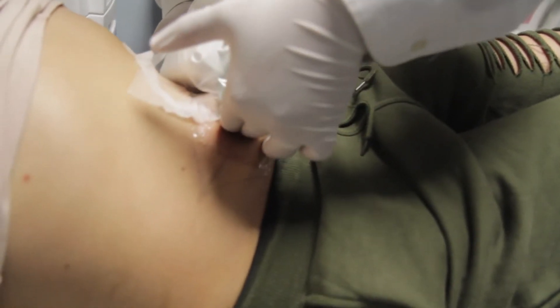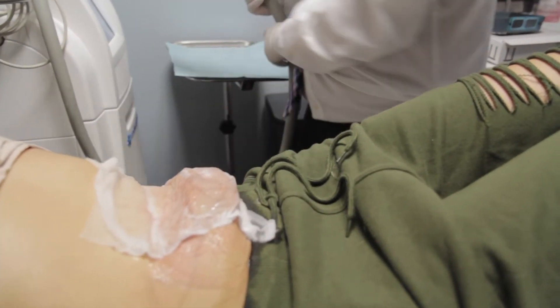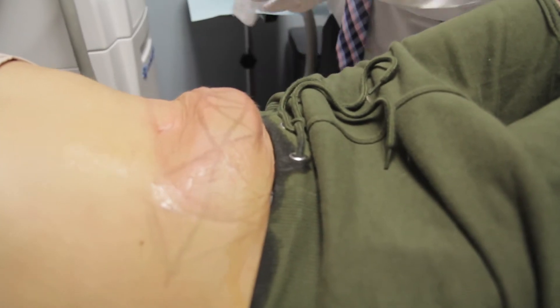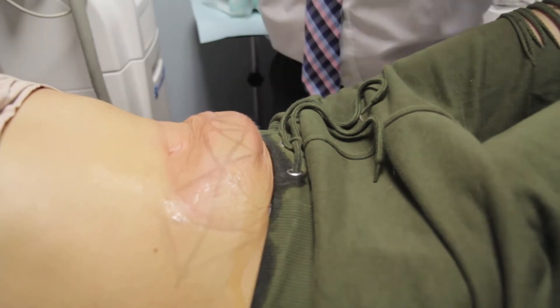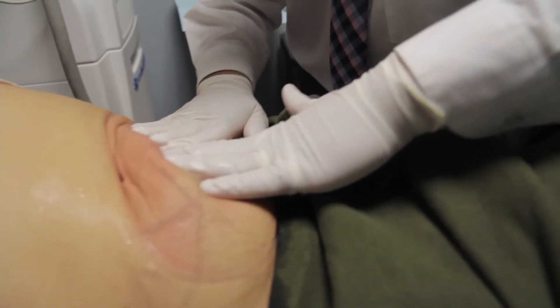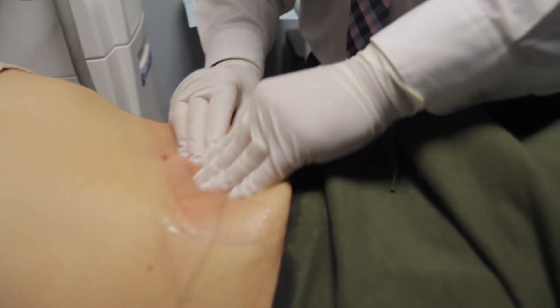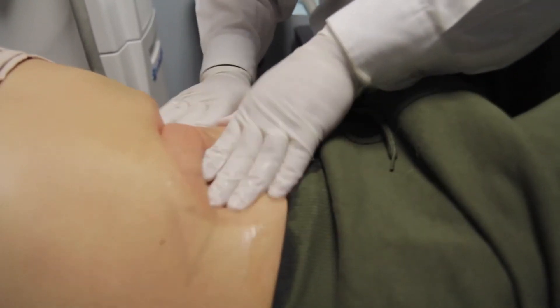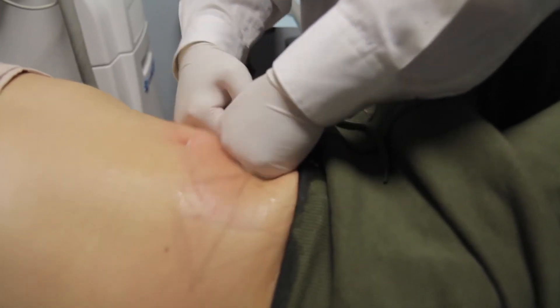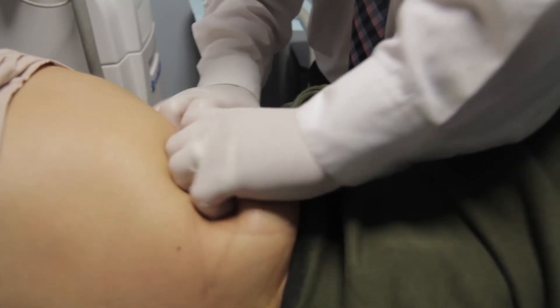So slowly we release it. Now I know you might be a little shocked, but what happens is that the suction pulls in the excess fat, so it kind of looks like this. Now this is the most important part of the procedure — we're going to massage the area gently. It's pretty cold, but we'll gently work through it. The protocol is to massage this for about two minutes. A lot of people say it actually feels good to massage the area afterwards.